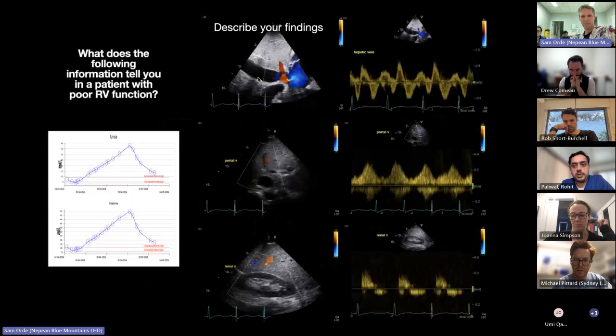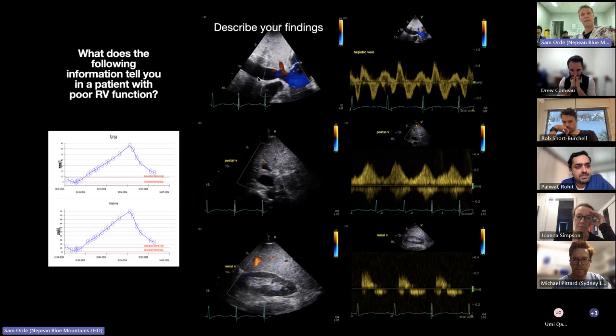Yep, nice. Yeah. And this one's VExUS. So definitely worth reading up on this. Hot topic. Lots of people are talking about it. Every course I've gone to for the last year, everyone wants to talk about this. The general thing I have for VExUS is it's good for looking at venous congestion, particularly if you've got some sorts of right heart dysfunction.